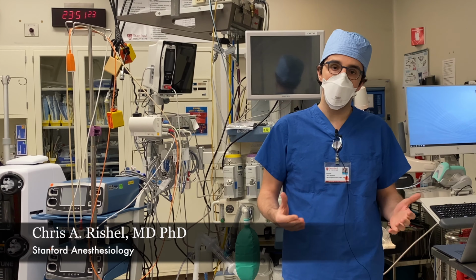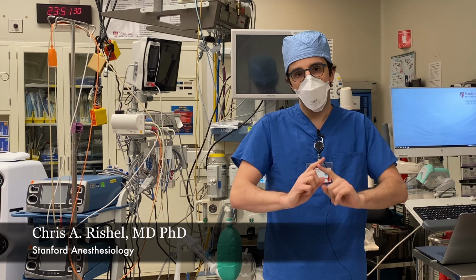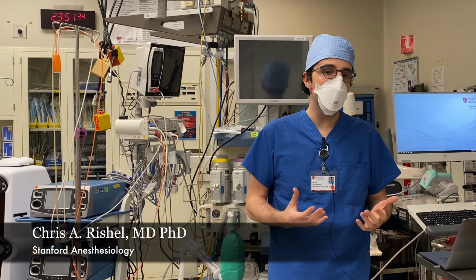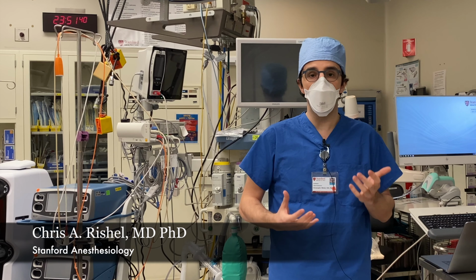Currently, ventilators are split in a passive way, which means you take one ventilator, you literally split the tubing and route it to two patients. This means that you don't have independent control over the ventilation parameters for each of the patients, and it presents what can be a very dangerous situation.